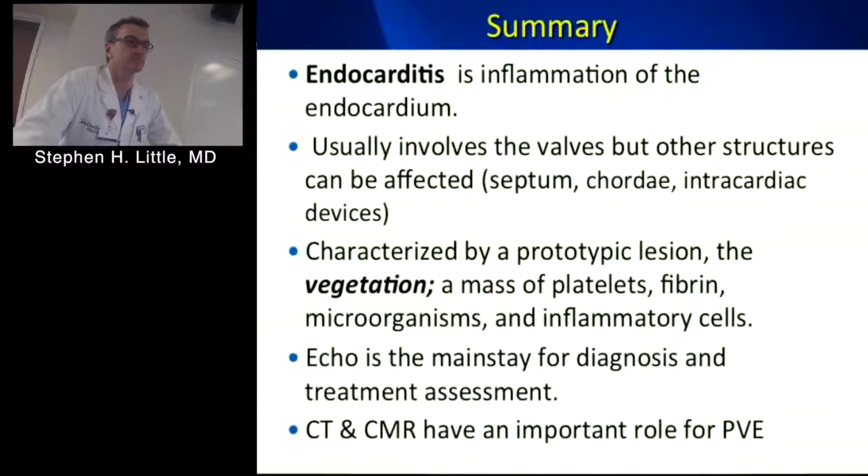Then the CT comes in, and you see that it's going everywhere, compressing over the vessels, all kinds of things, even with TEE. Absolutely, particularly the extent of the ascending aorta. There's a higher, like corkscrew, all the way up. So if you're planning surgery, I think the CT is very helpful. Certainly at our center, every surgeon gets a CT if they're considering surgery. And I think a lot of centers will do that as well.